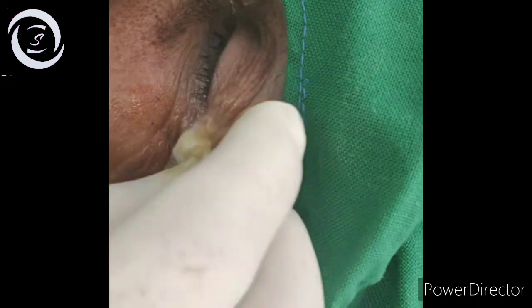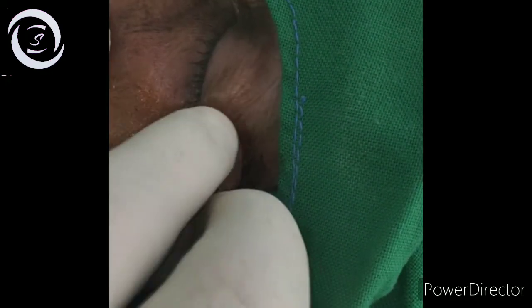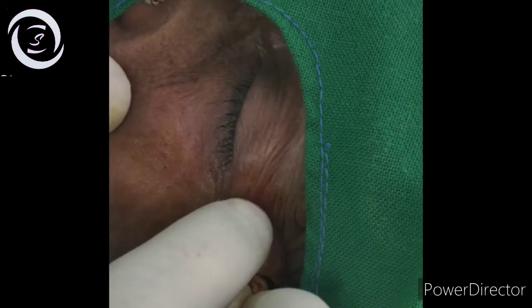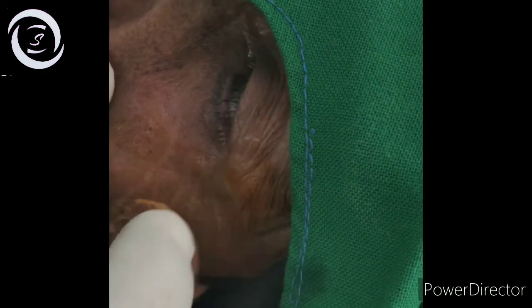The Van Lint facial block is more effective, has fewer complications, and is favored by most ophthalmologists compared to the O'Brien technique. I have demonstrated the Van Lint technique on two patients. Thank you very much.